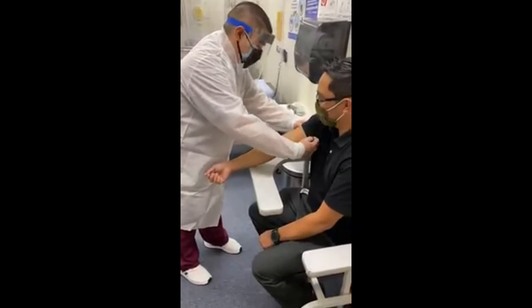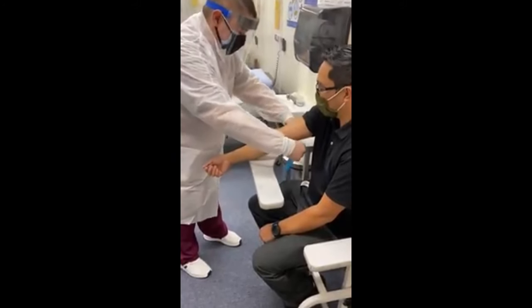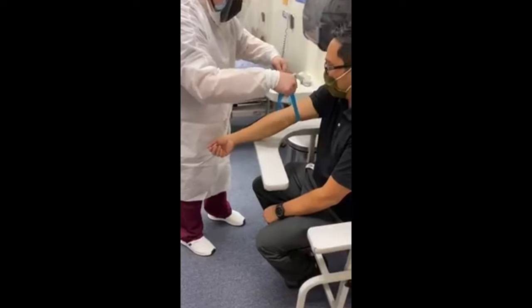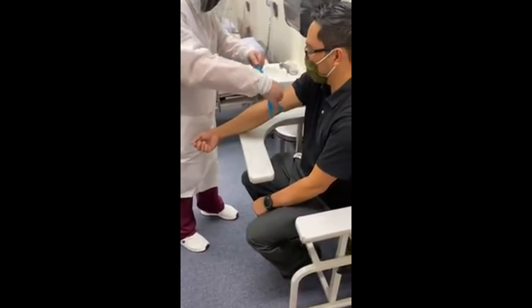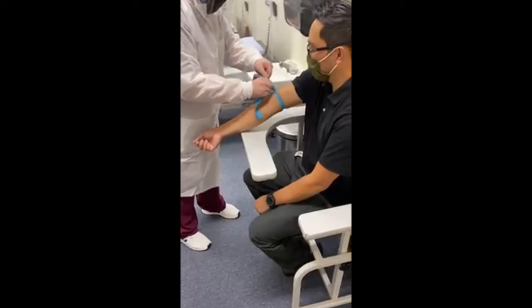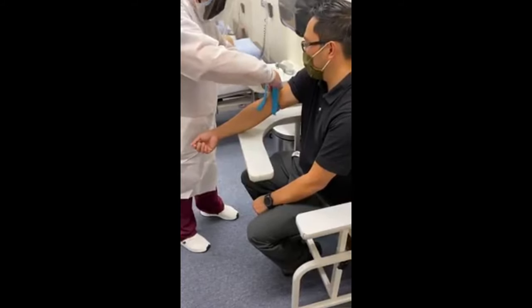Put this up like that. Go under the patient's arm. Pull 3 to 4 inches. Pull up. Then, hold on. Like this. Pinch right here. Like this.